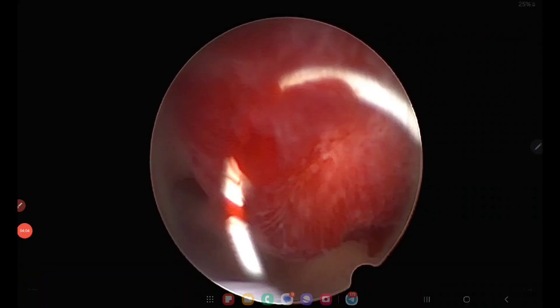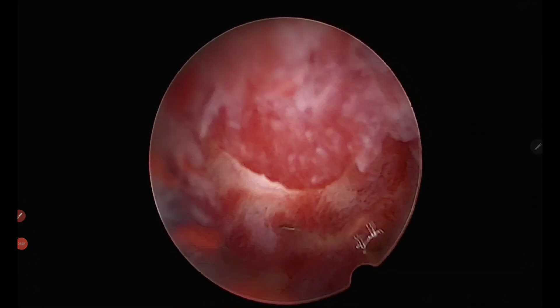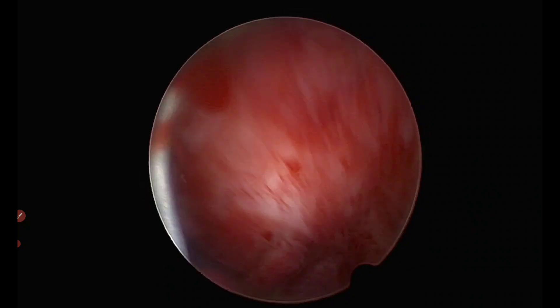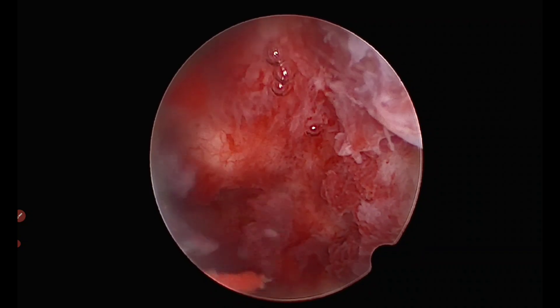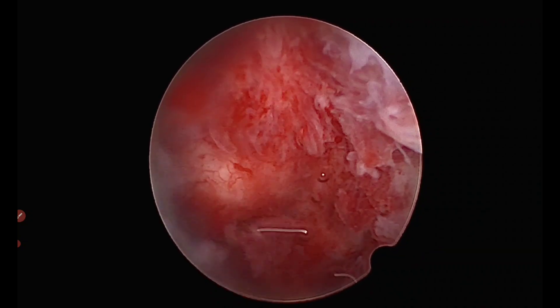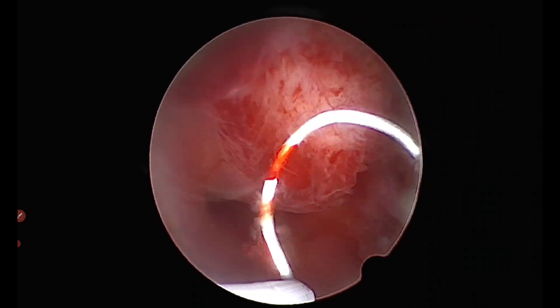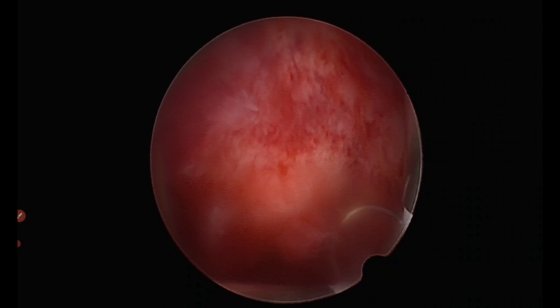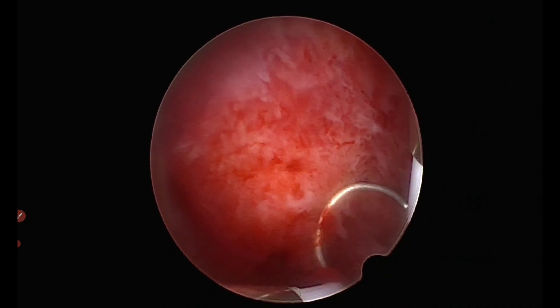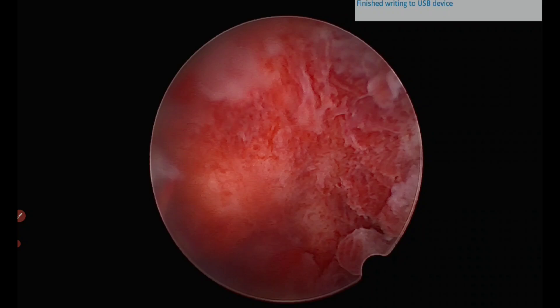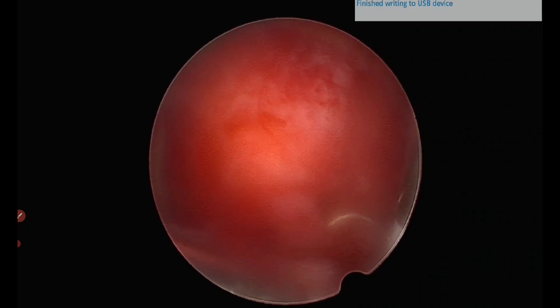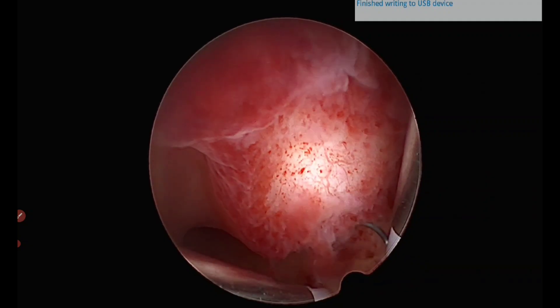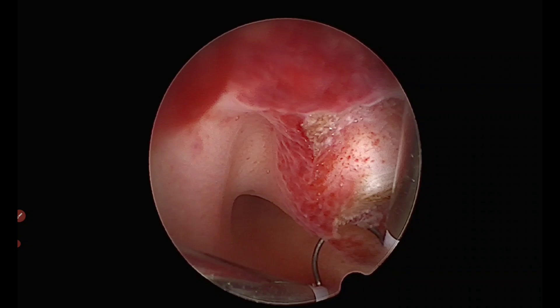As the operative case starts, notice how the picture changes with even one cycle of distension and deflation and re-inflation. Everything becomes red and there are mucosal hemorrhages. I am using a 22 French bipolar resectoscope with normal saline — we stopped using glycine a long time ago. This requires dilation up to Hegar number 7.5 or 8, and because of this dilation there are some artifacts created.